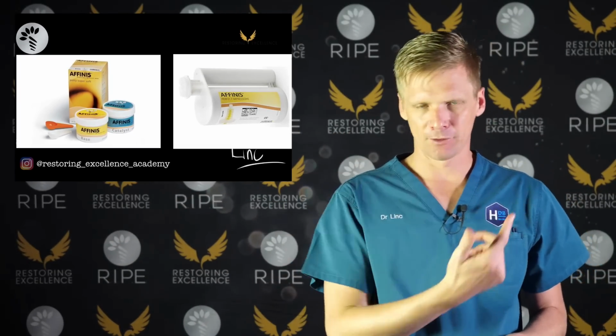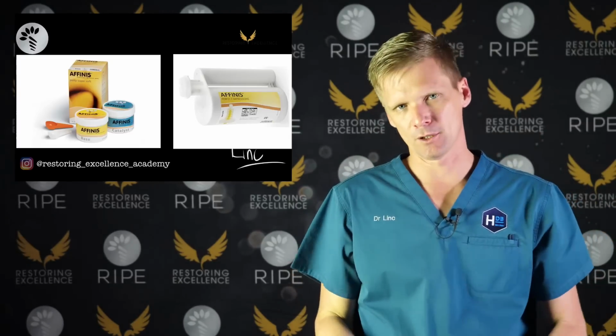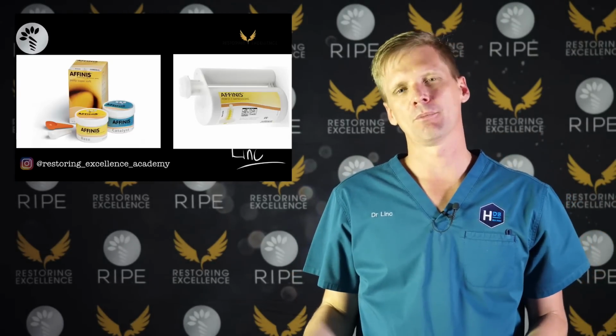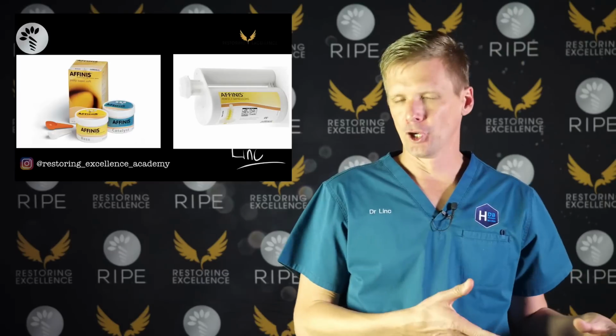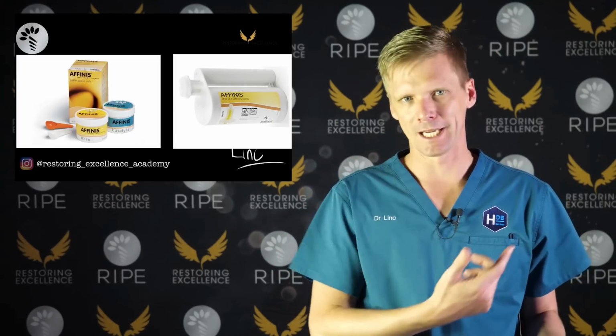But if you're doing a whole mouthful of crown preps, I find the compression of putty is much better at forcing the light body into all the sulcus, and I tend to get the impression the first go more often than if I use heavy body when I'm trying to pick up 12 or 14 teeth all at once.